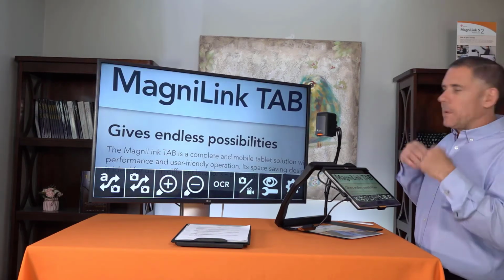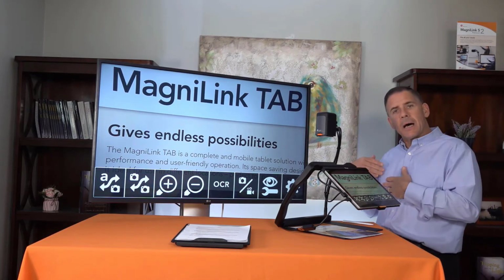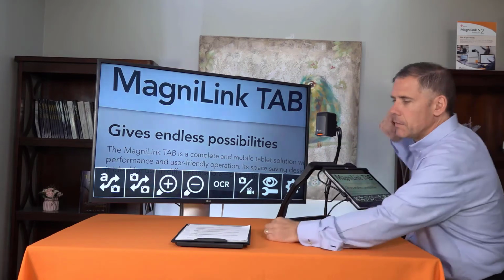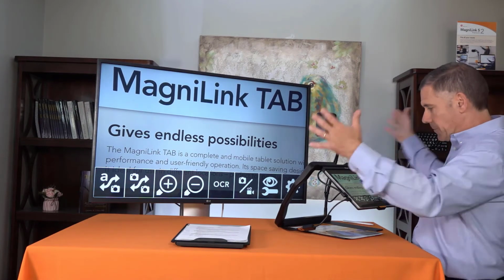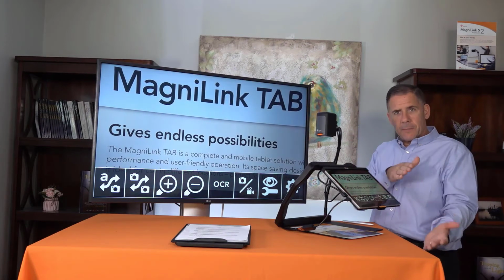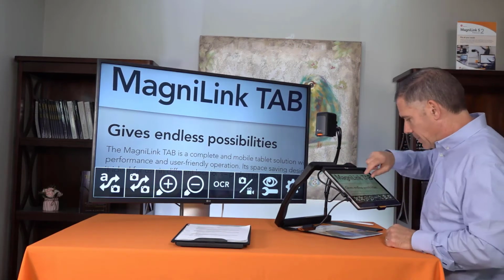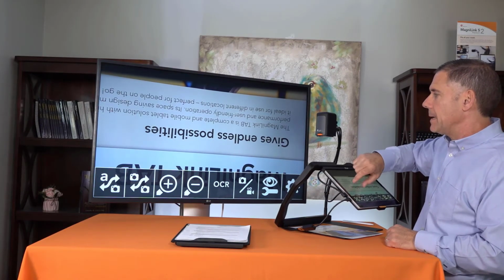So, you see I have it plugged into a large monitor. First thing you notice is where my camera is. It's not off to the side like we had to use it before. This is because I can rotate the image now. I can use this, bend it over, use it as a lefty. I can move it around, use it over here as a righty, but if I'm limited, I can pull it and use it behind the unit. So, tip it forward, or I can push the screen back, and then I can pull the camera forward and use it out in front. Very cool. Check it out. I just take my fingers and rotate until my image is how I need it.